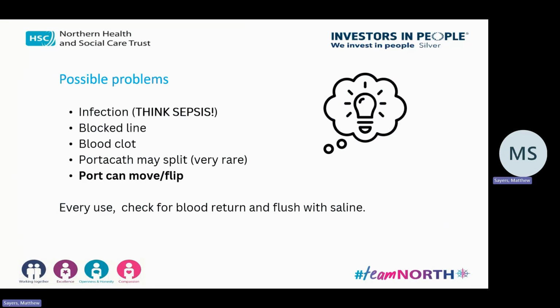You don't flip it back. Why do you not flip it back? We do have one girl from East London CCM who has support for really her access. She's complex health, and with hers, we just rang one day and said she has a nice little line coming out of her neck, and you can see it. We thought maybe we could go to the Royal for that. So she went, and you could clearly see the tubing sitting in a big loop, up in her external jugular, and you could palpate it, you could feel it.